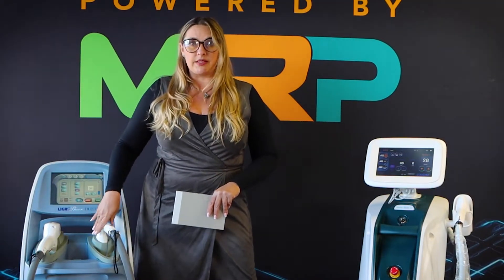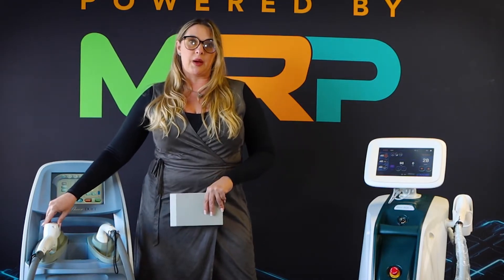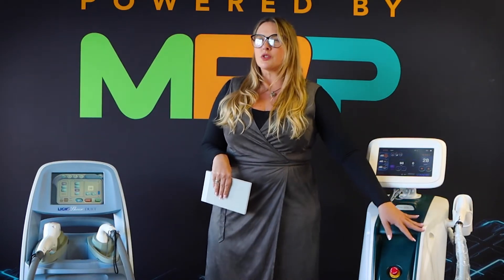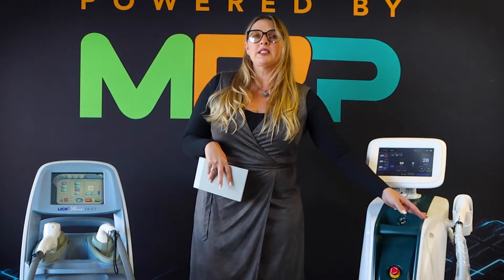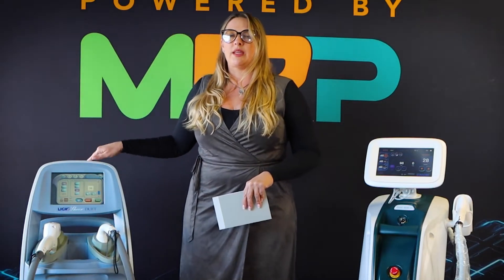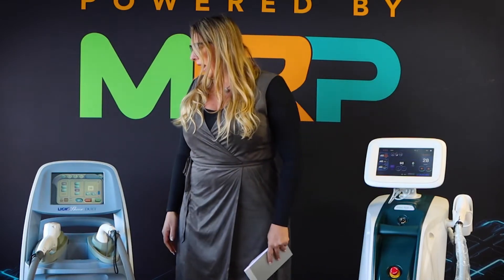The Duet has two different handpieces — one is vacuum assisted, and one is that small 12 by 12 millimeter spot size. Whereas the Bear has only one handpiece, and that's a 14 by 14 millimeter spot size, so slightly bigger. In a clinical treatment, the bigger spot size means we go slightly slower at a maximum of 2 Hertz, whereas with the Duet it's a smaller spot size but we can increase our Hertz up to 3, so it kind of equal balances it out.